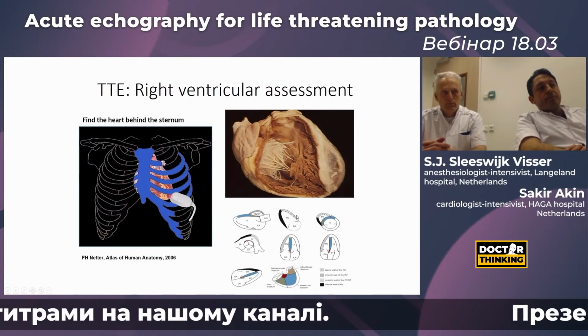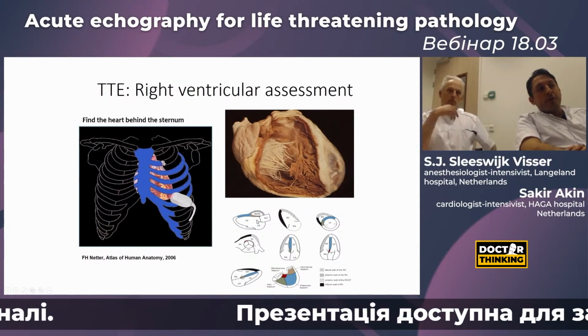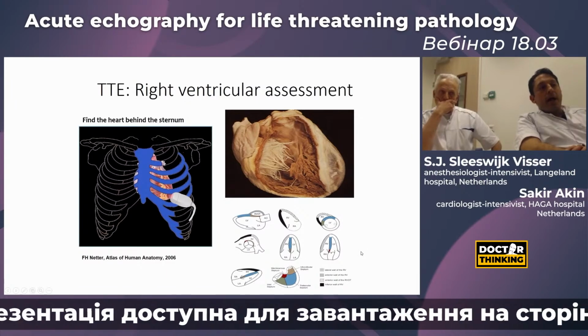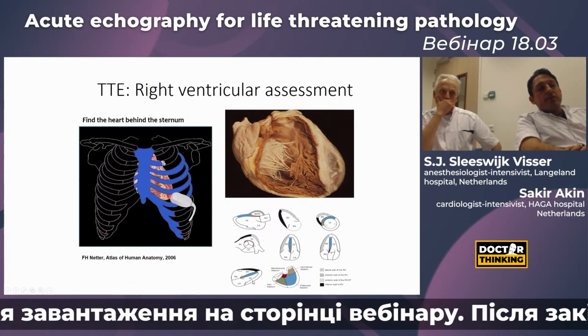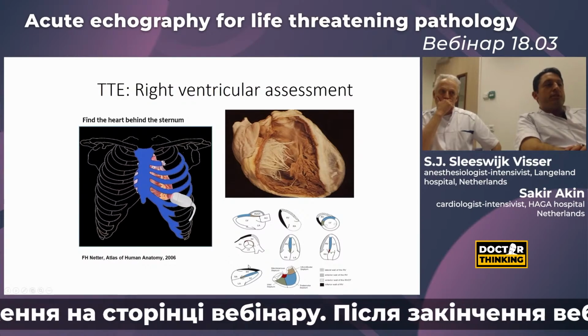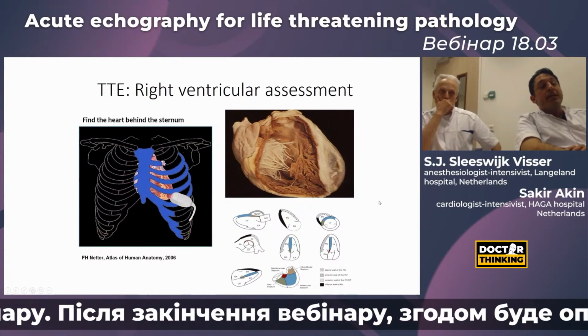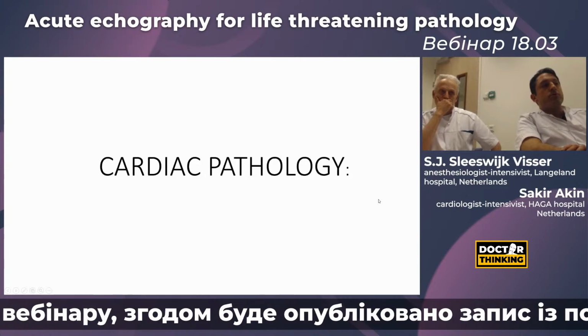So you can measure right ventricle function and dimension from parasternal long axis to short axis to apical views, and when we started with subcostal views, then you have the best view of the right ventricle, completed by doing this sequentially in different windows.